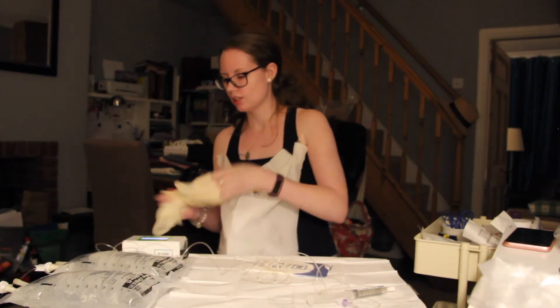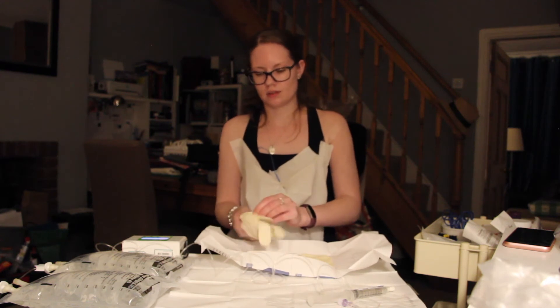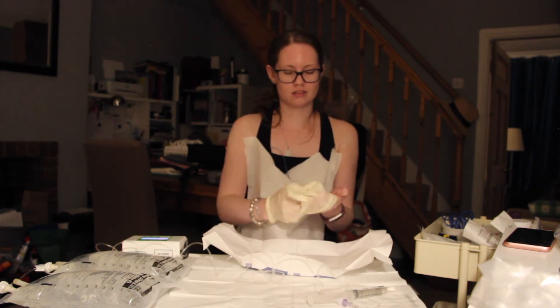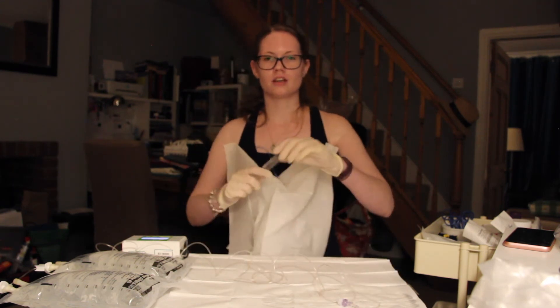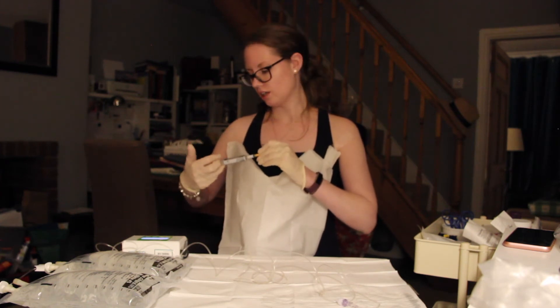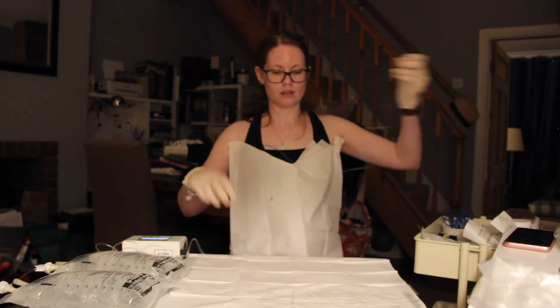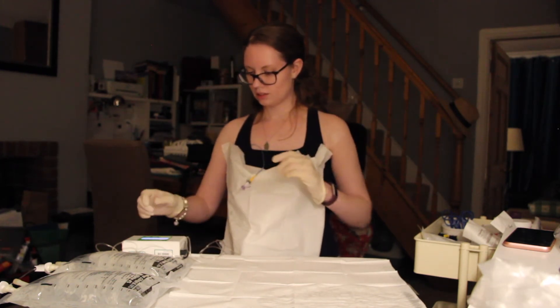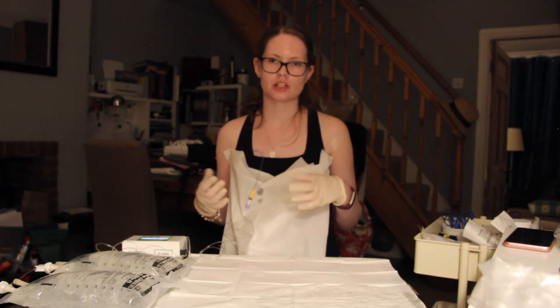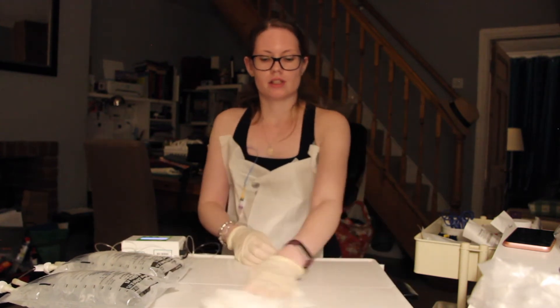So the next thing to do is change your gloves, because we're going to touch the line. I'm trying to do this before my camera battery dies. Okay, so next thing we're going to do is flush the line. You do this in a push-pause motion and it's to increase the amount of pressure in the syringe so it flushes the line better. And then we're going to connect the giving set and press start. My line doesn't have a clamp — it's a Groshong line so it has this little internal valve that opens under pressure. Depending on which way the pressure is, it opens inwards or outwards. When there's nothing going through it, it's closed. So that is my fluids setting up.